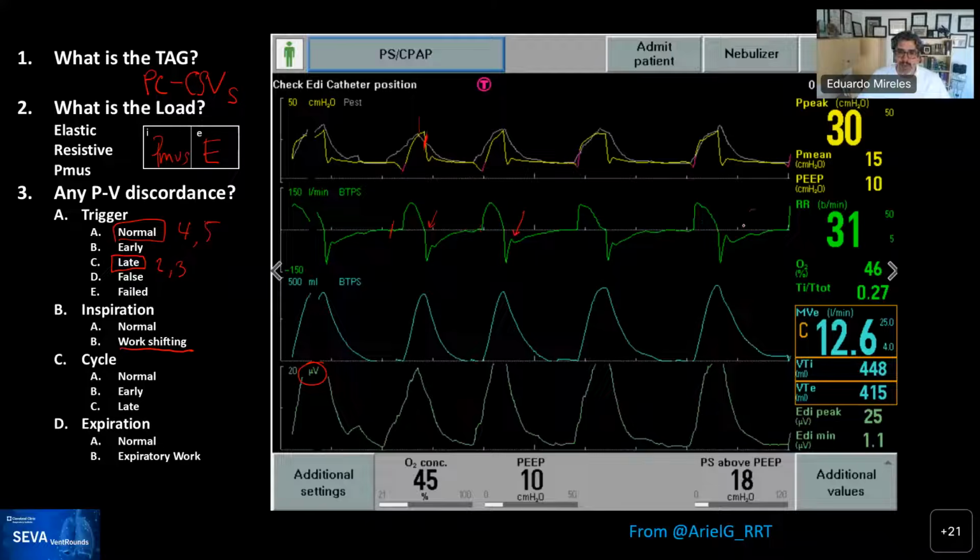And technically, if you were grading these, you would grade a lot of these interactions as either delays, early, or late in terms of synchrony, and they may not be clinically relevant. They may be. I'm not sure. But this was pretty close in terms of synchrony. Actually, when I was looking at the waveform, I said, oh, that's pretty close. That was my feeling. Thoughts, Rob?